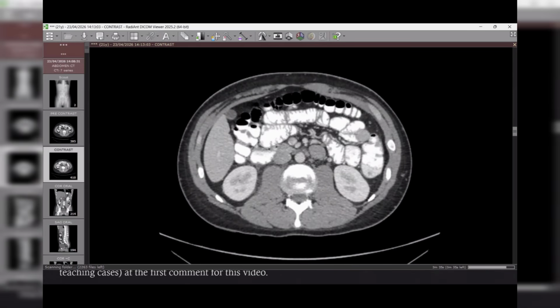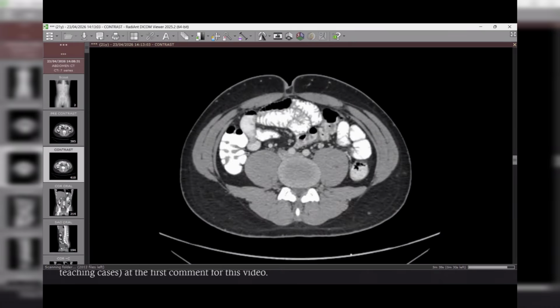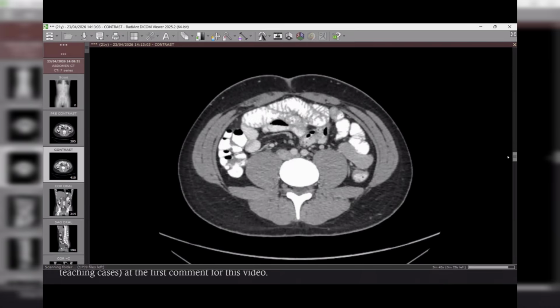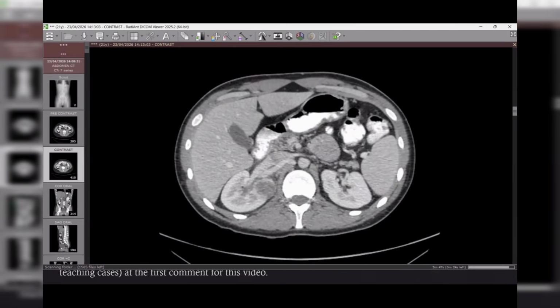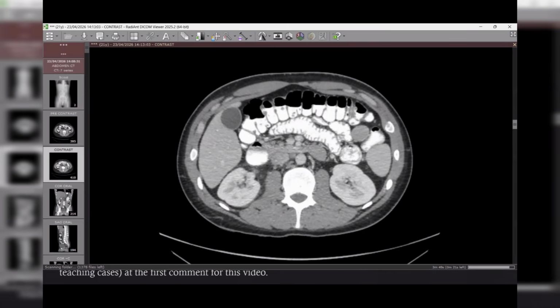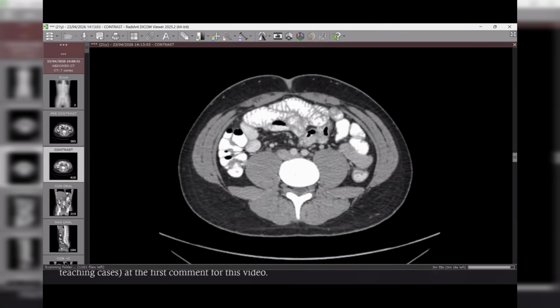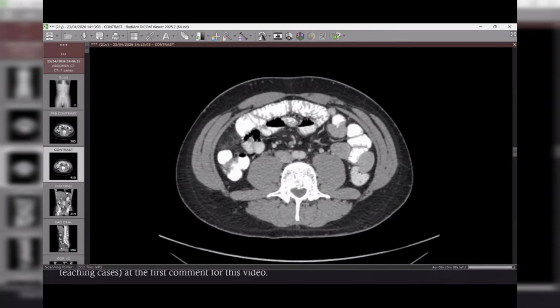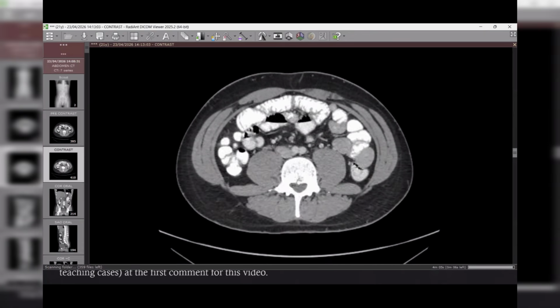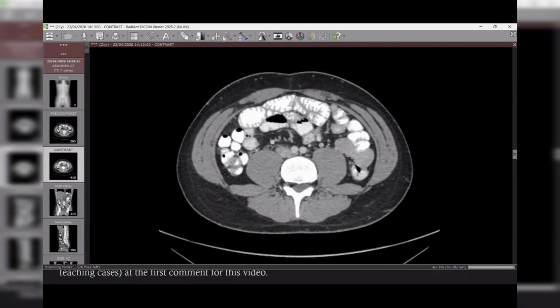It appears to extend. I lost it, just one second. Yes, it appears to extend down to the pelvis. Again, down, down. Okay, it appears it ends here. I will go down more. Is it a blind end, or is it very large?